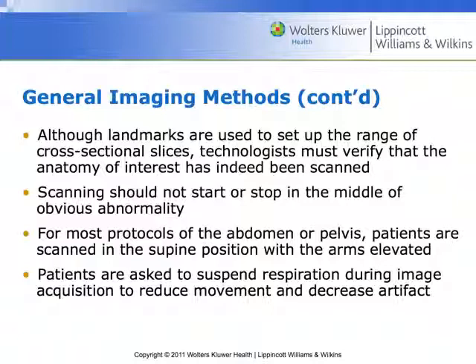If, for example, you notice an abnormality on the liver, but due to patient breathing a portion of the abnormality was clipped or missed somehow, scan through the entire organ again, just to allow for proper measurements both in the X and Y plane as well as in the Z axis.